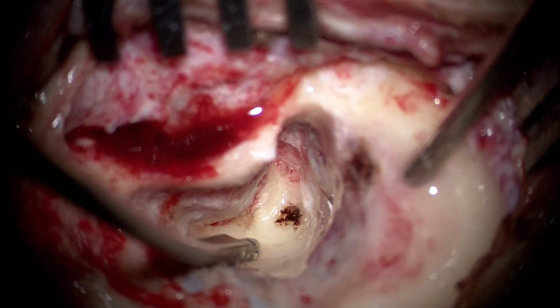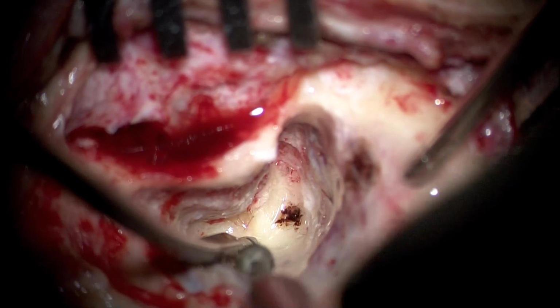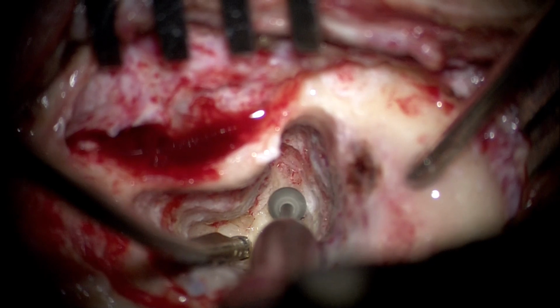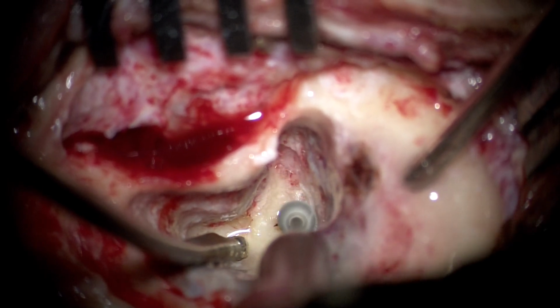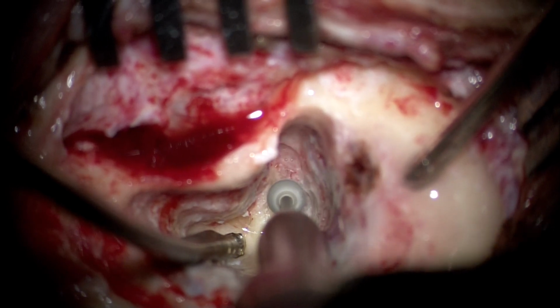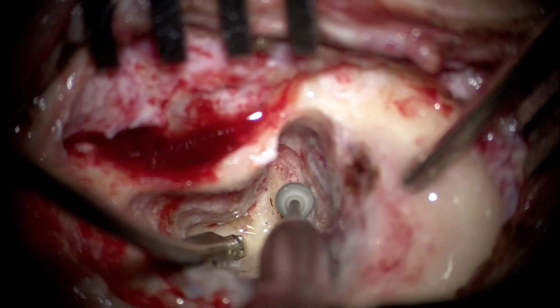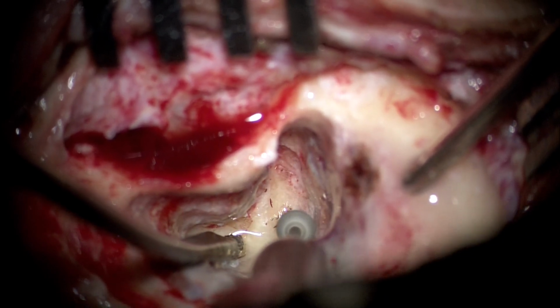The vestibule now seems completely open. The vestibular duct has been opened. The endolymphatic duct has probably been drilled. The endolymphatic sac is now open. We are just using another diamond burr here to see if any other part of the canal is still left for us to be drilled before we can commence the removal of this sensory neuroepithelium from the vestibule.